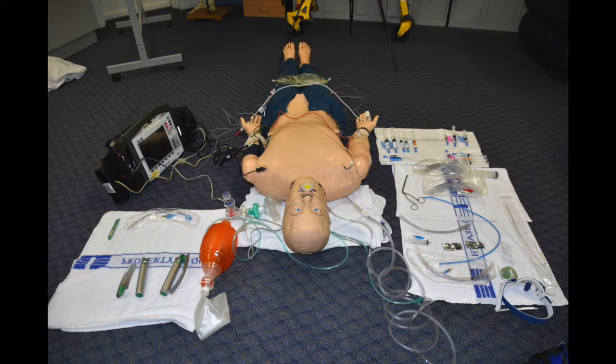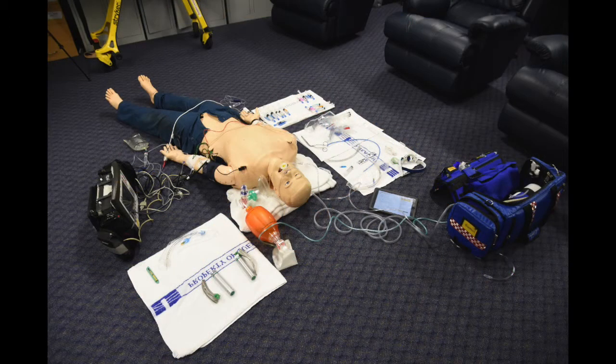So as you can see, I've got all my equipment ready. I've got all my bag valve mask and my laryngoscopes, and I've got all my primary airway stuff, and then also my emergency airway fallbacks, and then I've also got my drugs down in the corner there. So this is how I'd have my scene set up, and this is at a different angle.